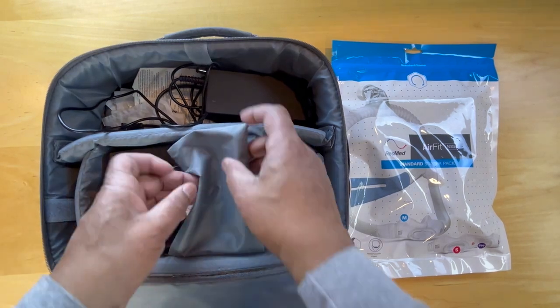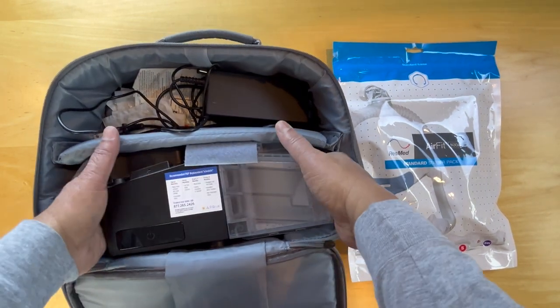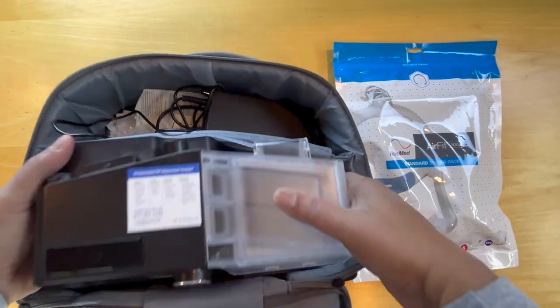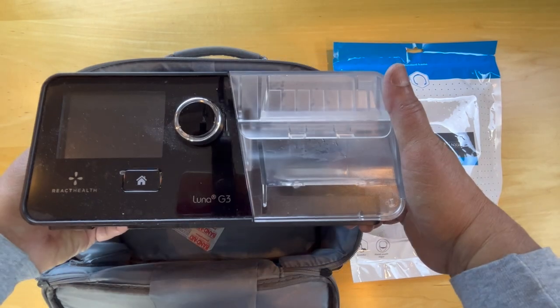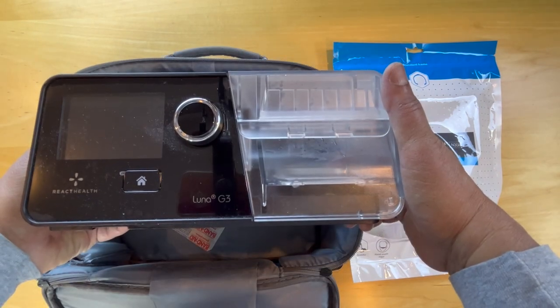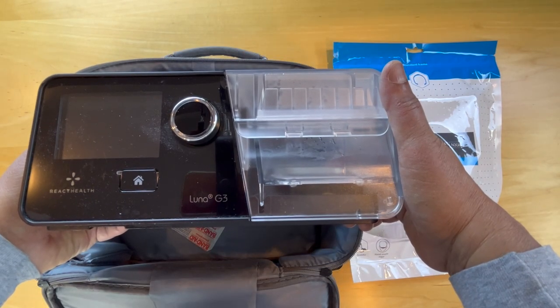In it we have the CPAP unit. Let's take a look at this. It's actually a React Health Luna G3.